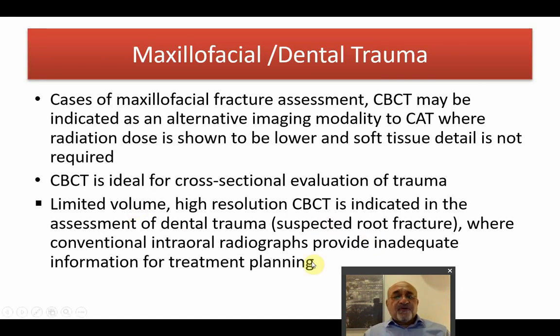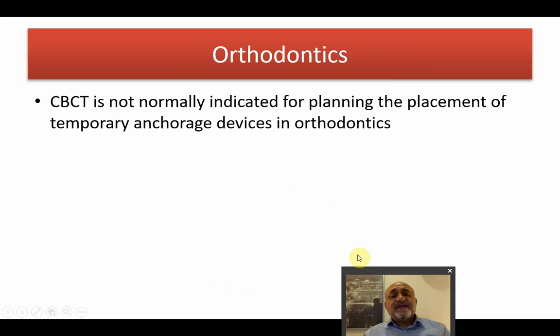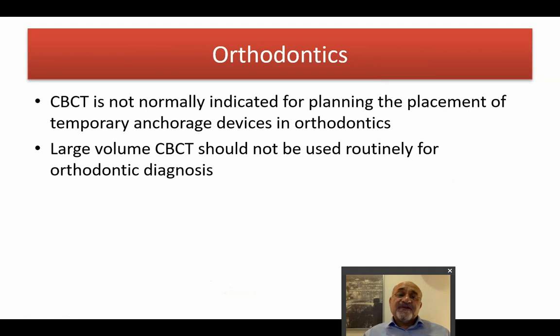Root fractures, where the conventional intraoral radiographs provide inadequate, incomplete information for the treatment plan. In orthodontics, CBCT is not a routine or standardized procedure for planning the placement of temporary anchorage. Large volume CBCT should not be used routinely in orthodontics. Again, we are considering the dose.